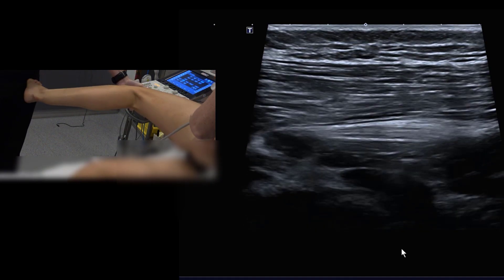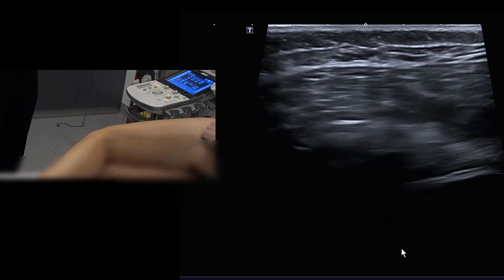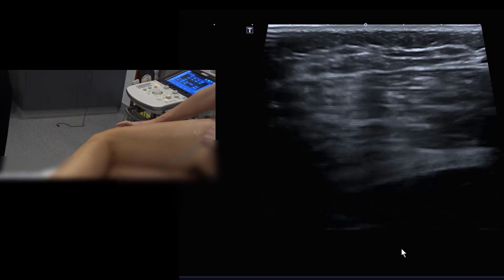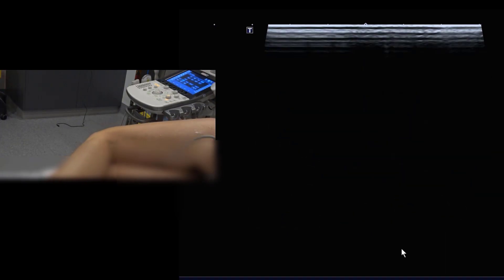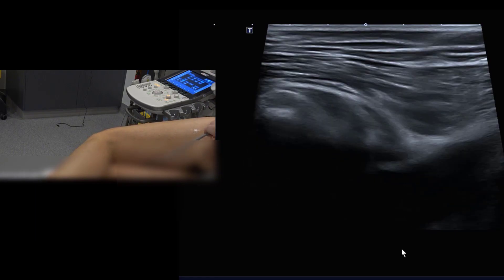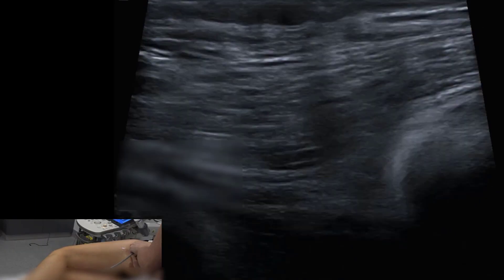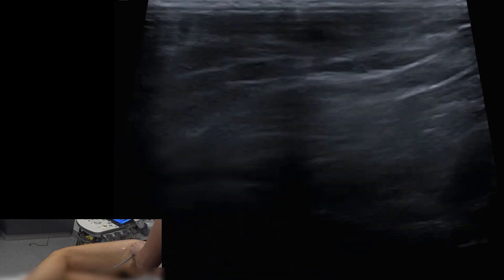The nerve shows clear excursion back and forth. This maneuver is quite challenging — the patient may need to hold the table, and a pillow under the knee can help if scanning alone. We can then repeat the same assessment in transverse, finding the quadratus femoris and performing the same hip flexion, dorsiflexion, and knee extension protocol.